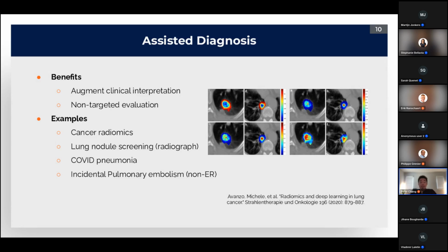Another interesting use case was early in the COVID pandemic, right? The ability to identify findings characteristic of COVID in a new pandemic setting was difficult for folks that just didn't have a lot of exposure to the disease. These are things that we now know many years later, but early on in the process, the use of machine learning can certainly help augment that workflow.